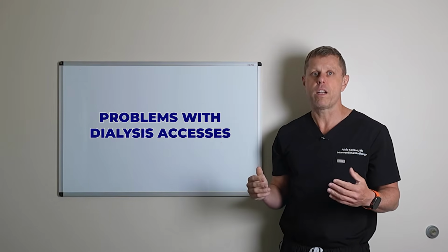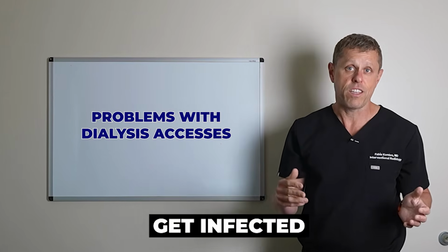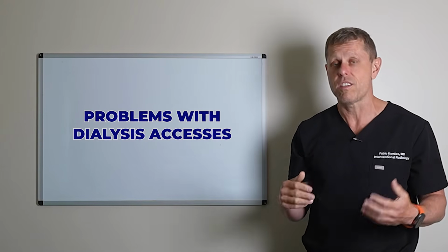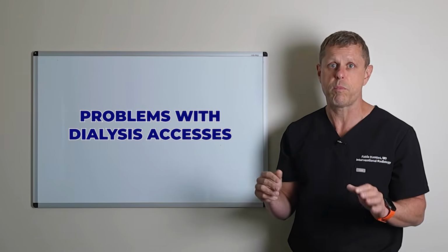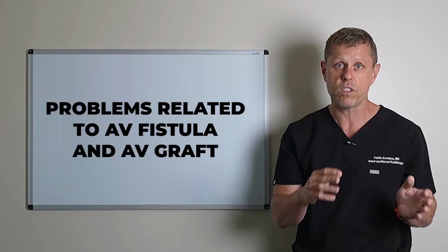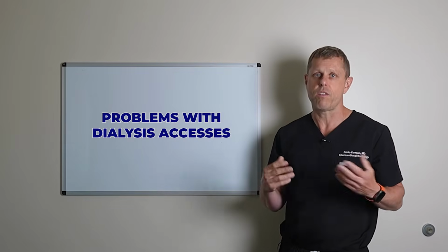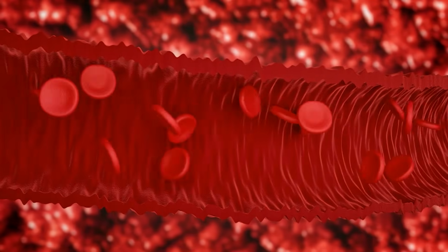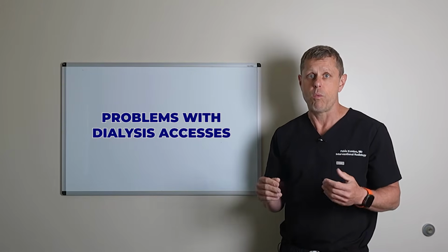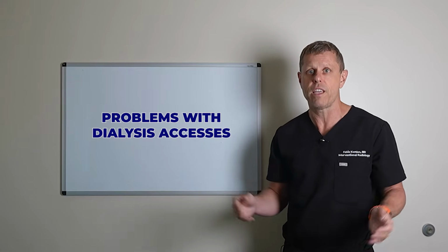Like I mentioned before, there are several problems with catheters. They can get clogged, they can get infected, causing sepsis, and they can also scar the veins inside your body. But in this video, I'm going to be focusing on the problems related to the arteriovenous fistulas and the arteriovenous grafts. Both allow the blood to flow very fast during dialysis, but sometimes problems can develop. When they do, they need to be addressed quickly since you obviously need dialysis.